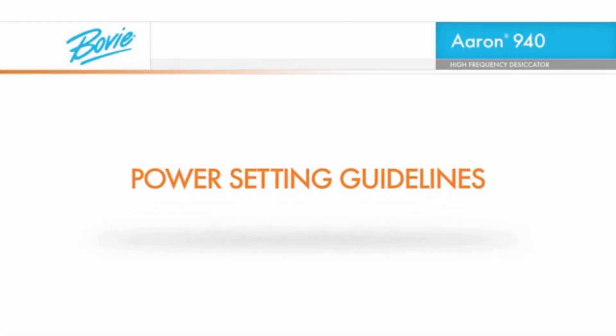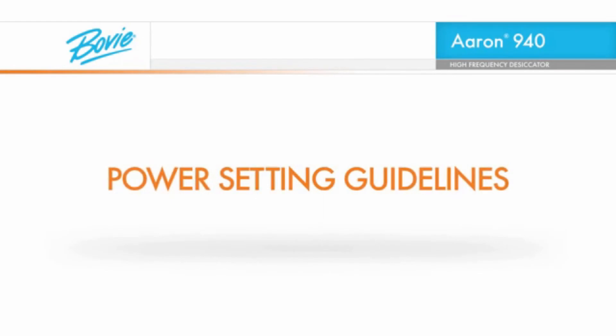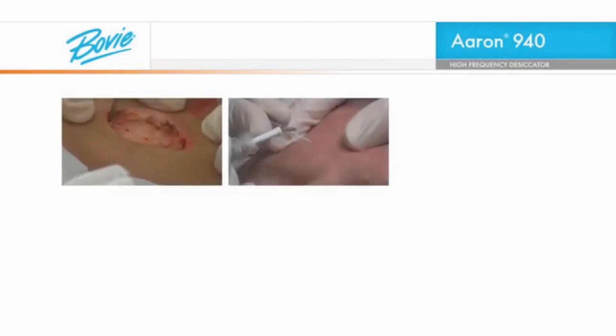The following are the suggested power setting guidelines for the various applicable procedures. That's a quick look at some basic procedures.